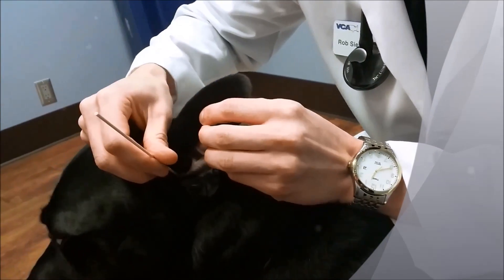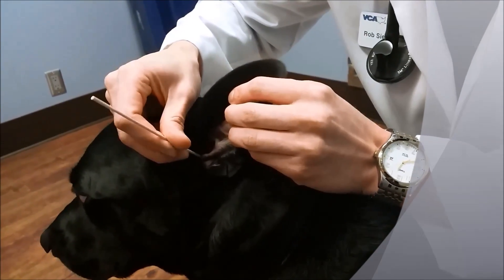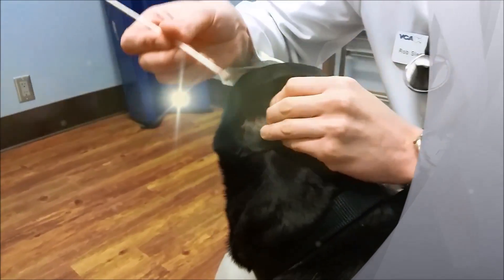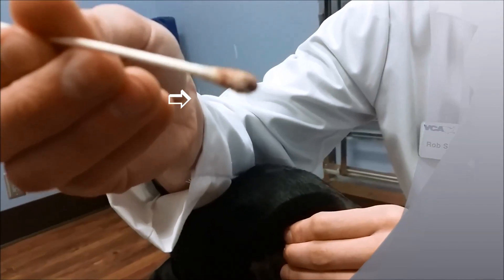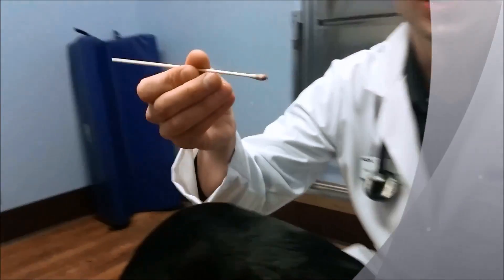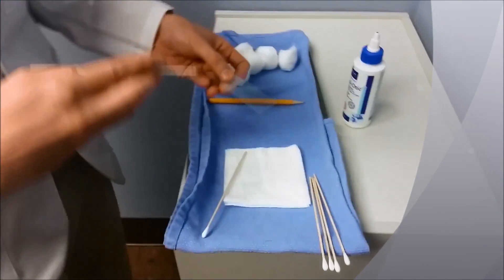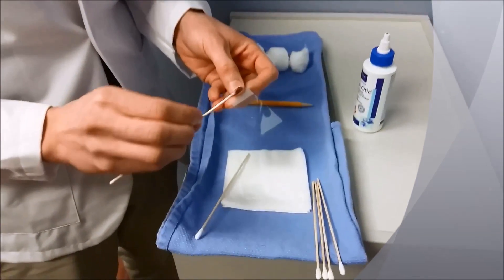I'm going fairly deep but not pushing, and I'm just rolling my Q-tip trying to collect some of that junk in there. A lot of debris there. So let's go ahead and take our slide, and then I'm just going to roll it out. So that's his left ear.